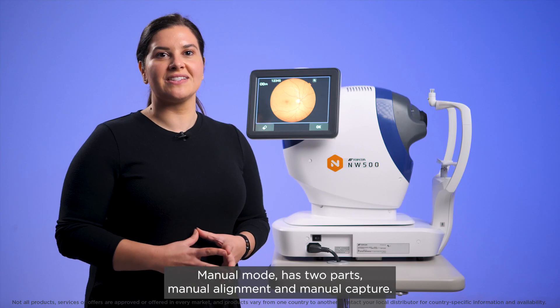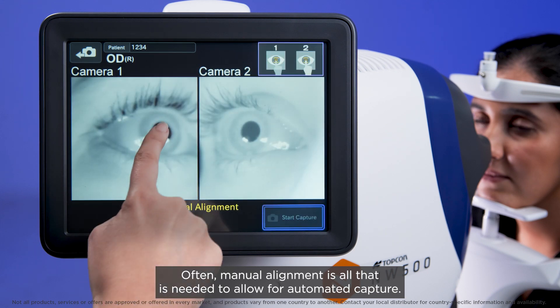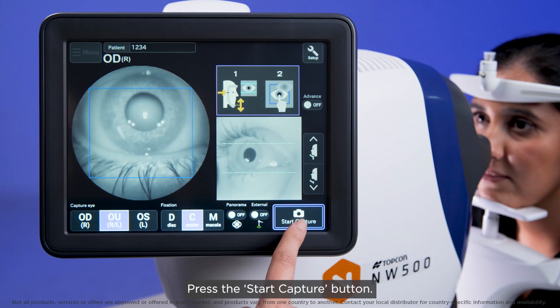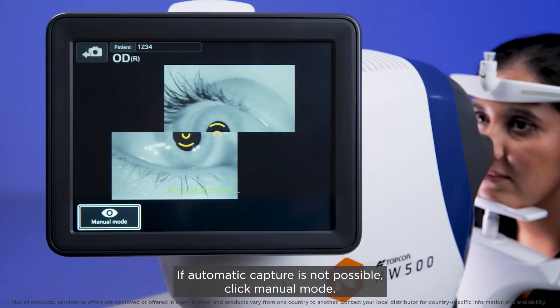Manual mode has two parts: manual alignment and manual capture. Often, manual alignment is all that is needed to allow for automated capture. Press the Start Capture button. If automatic capture is not possible, click manual mode.